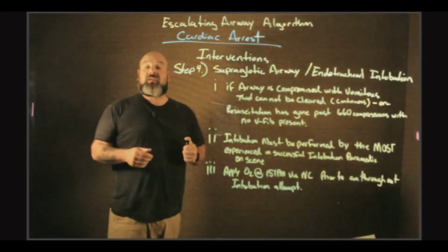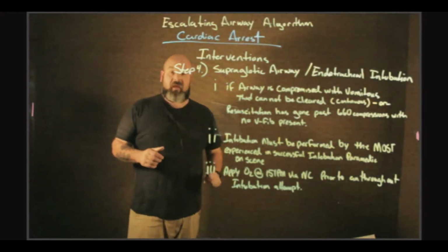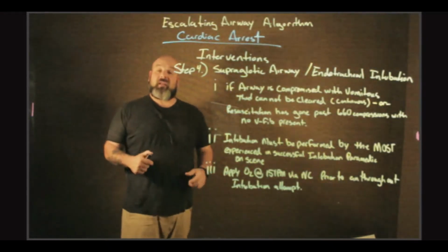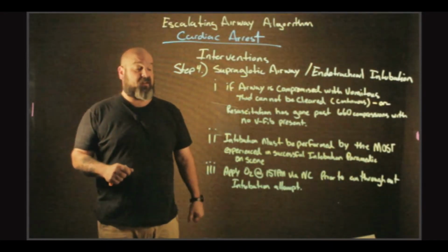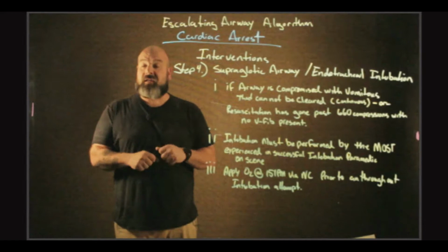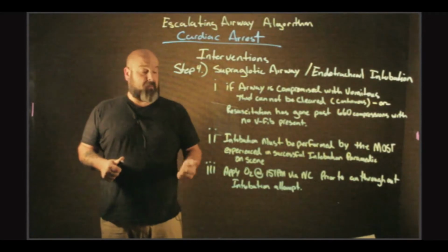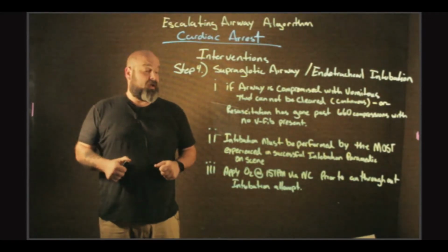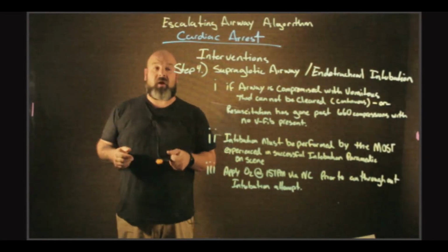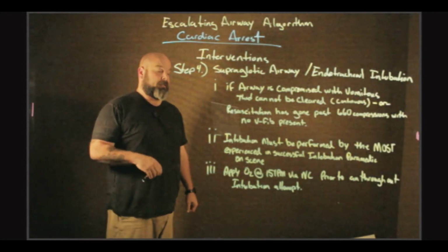We are going to continue our end-tidal CO2 monitoring before that first breath into that ET tube as well. We should have been monitoring end-tidal CO2 through any kind of bag mask ventilations. We are absolutely going to place an end-tidal CO2 adapter to our ET tube and bag valve, to monitor that first breath going in through endotracheal intubation. Not only is it going to give you the indicator of your patient's condition, breath to breath, it is also going to confirm that that tube is placed in the proper location in the trachea as well.